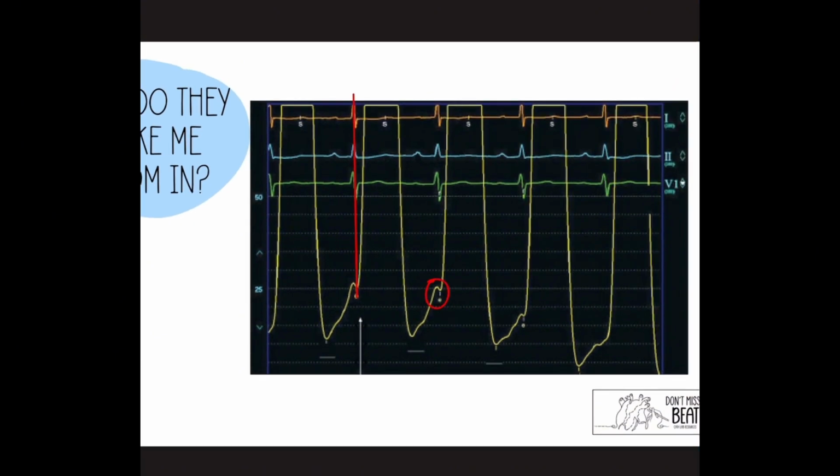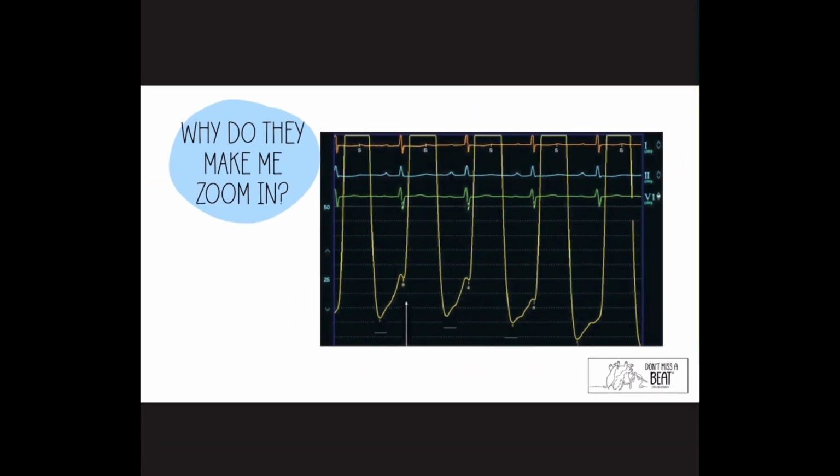You'll notice it does mark out the EDPs for you. It's saying, hey, I'm measuring here, but it doesn't always go in the correct spot, which is why this moment is important for you to look at the QRS complex, have an idea of what EDP is, and verify, yes, it is measuring at the correct place, because we diagnose a lot off of EDP. It tells us a lot about left ventricular function.